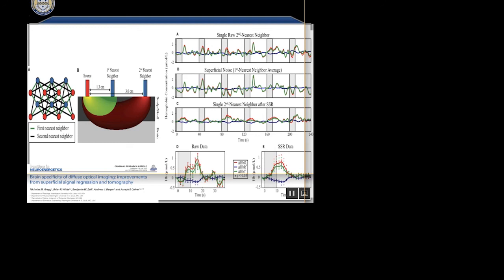So before I even get into this too much, one thing, like I said, we don't recommend spring-loaded. This is a spring-loaded solution right now. You shouldn't use spring-loaded with motion. However, you could use these with our fiber optic TMS programs. So we would need to come up with something that is basically more like the standard ones, like these. That works a lot better than this, so hold it tighter, but not spring. What we have is spring-loaded.